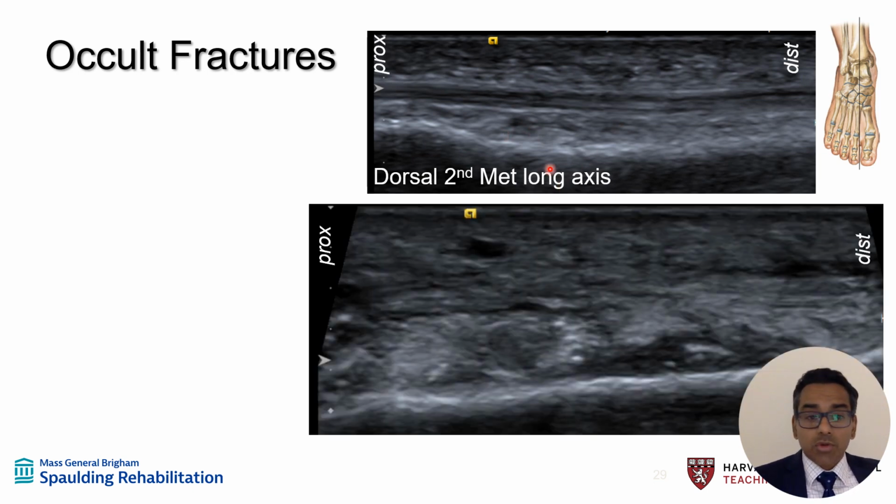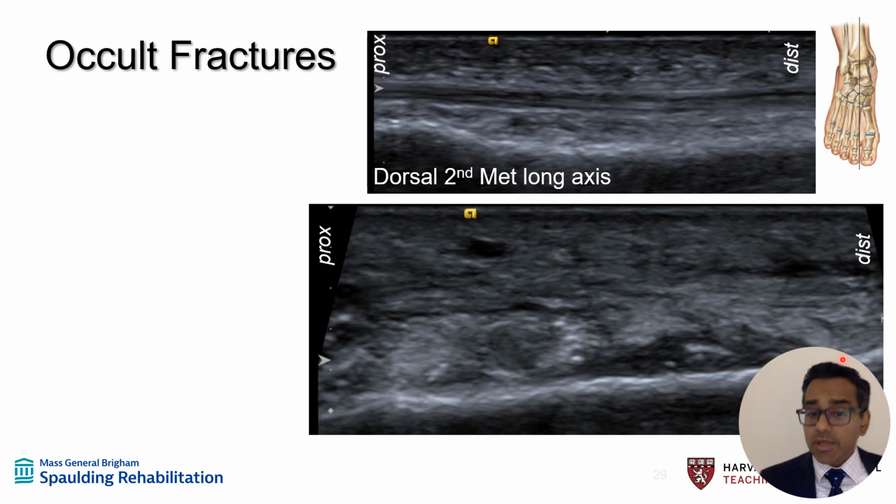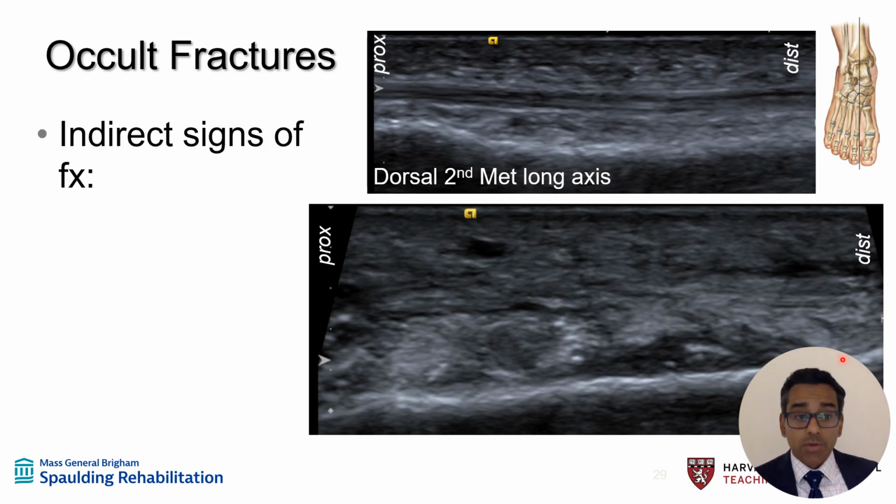However, when you look with ultrasound, what we see is quite a different story. Here you'll see a nice bright cortical border with shadowing deep. We see the same kind of thing, except there's one area right here that looks quite abnormal. A hyperechoic structure, no shadowing deep to it, but lots of surrounding edema. This should make us quite concerned for an injury to the bone itself.